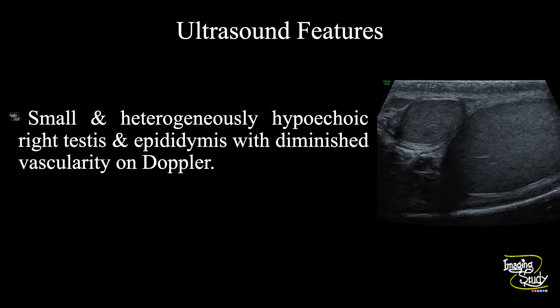So in summary, a small and heterogeneously hypoechoic right testis and epididymis are seen with diminished vascularity on Doppler, suggesting this to be a case of chronic epididymoorchitis.